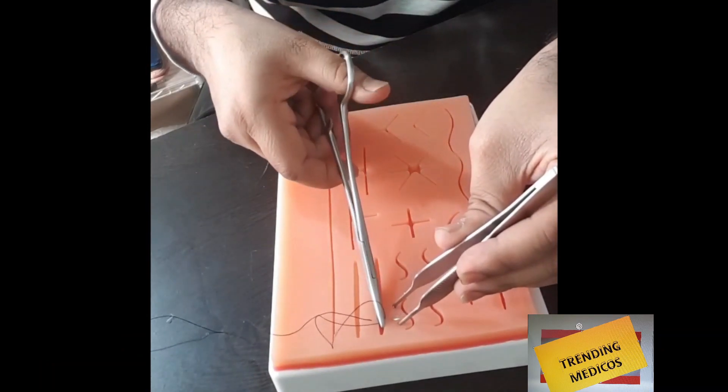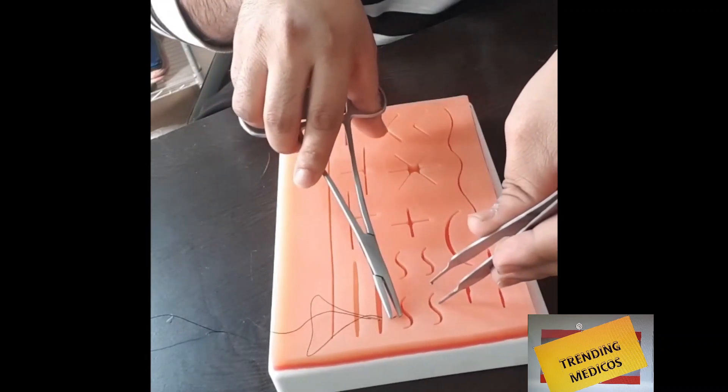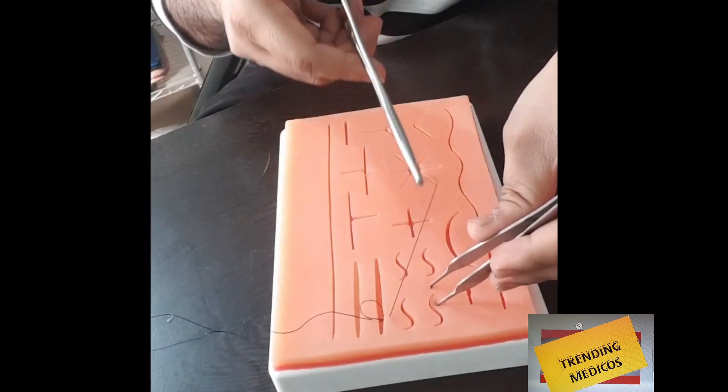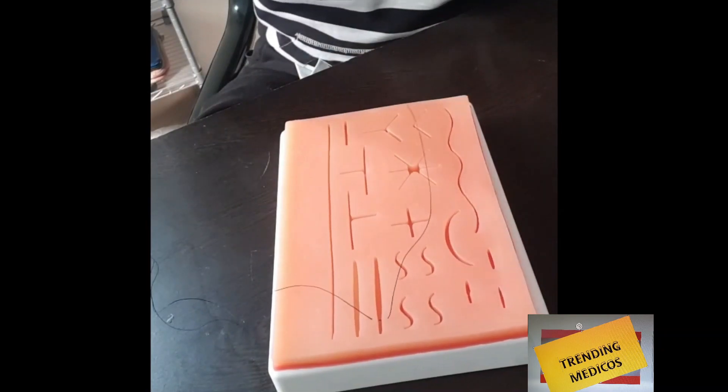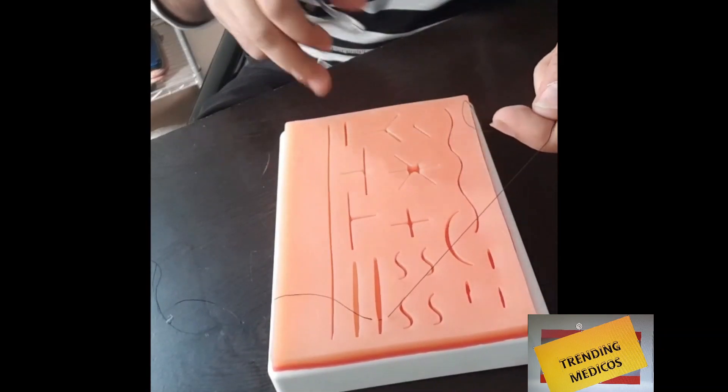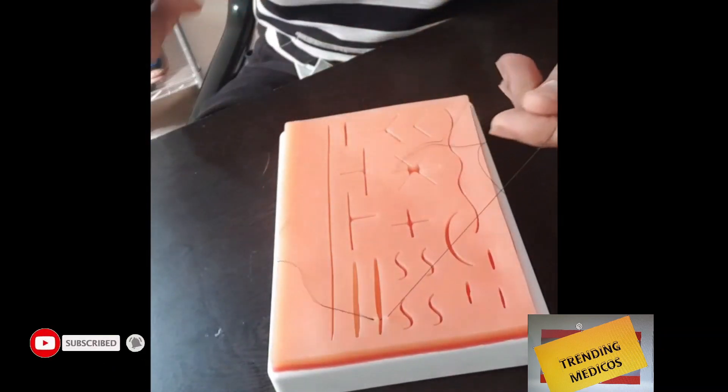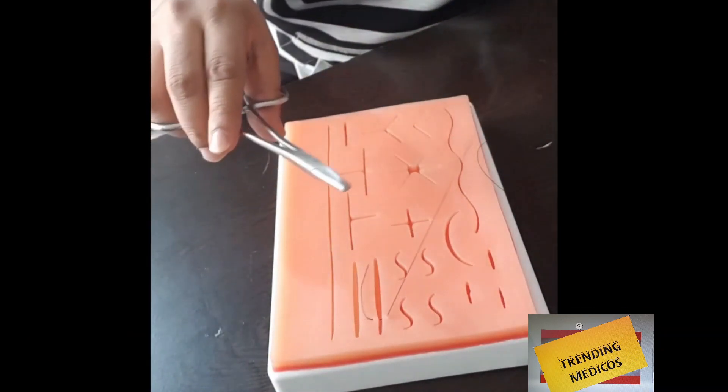When you're through with both edges, pull out the thread completely. Now you have to make the loop.